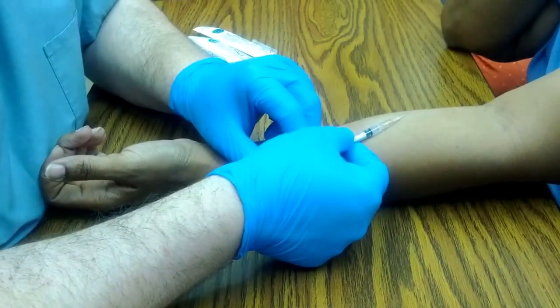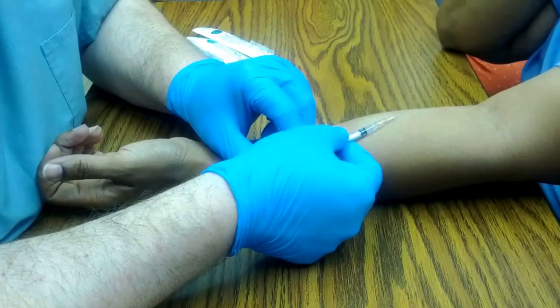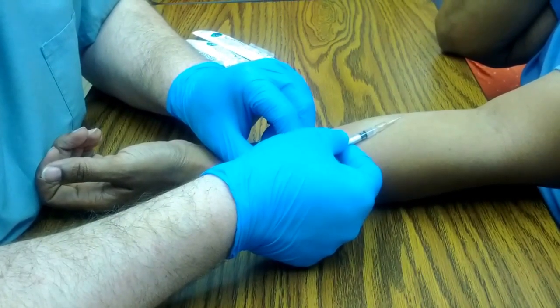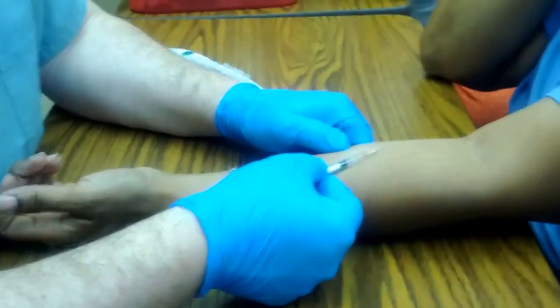And ever so gently, I'm going to inject just a little bit. Now the water is bacteriostatic, so it burns a little bit. So my apologies. Just like so. And so, just like this. You see the little bubble that formed over there? That's all I need to do.